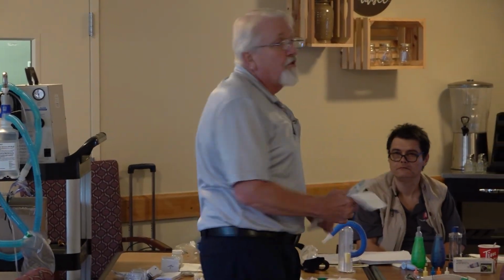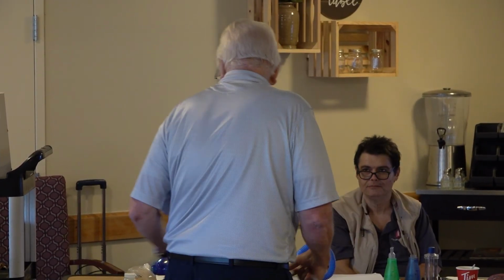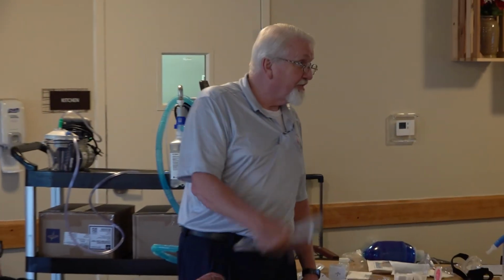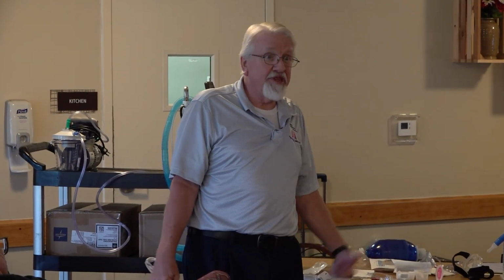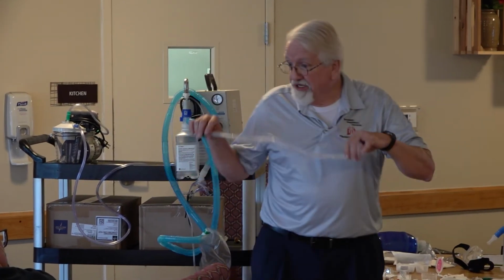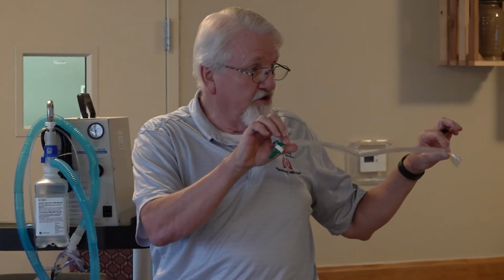Now remember, the single-use catheter, which is what we just used, you're going to throw it away. Don't stick it in that little pack and put it back in the drawer for when somebody else comes. That just drives me crazy. You come in there, the pack's been opened, it's been used, and how long has it been left? I don't know. It's crazy.